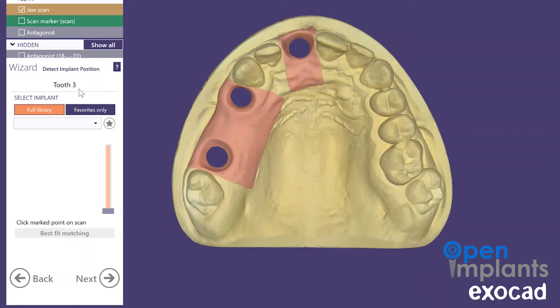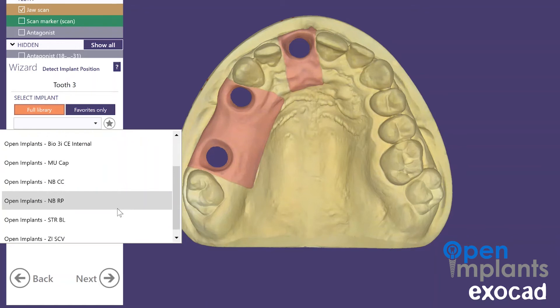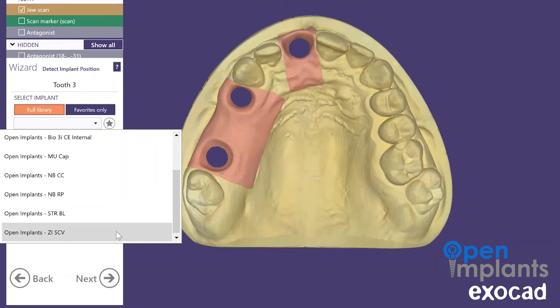The first step in the abutment design is to select the implant library. Make sure that you are always checking the right implant site. We're going to select the Zimmer Screw Vent 4.5, so we'll go here.